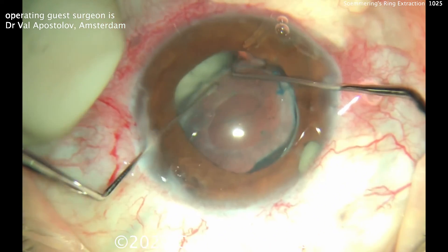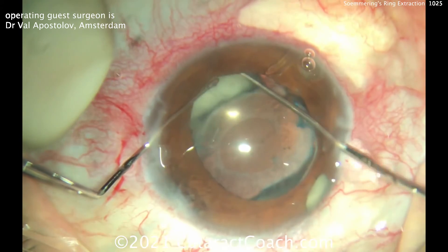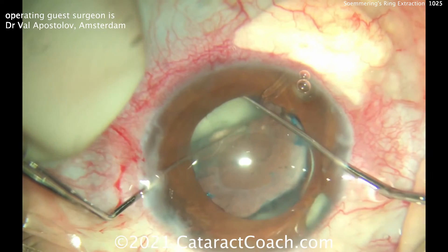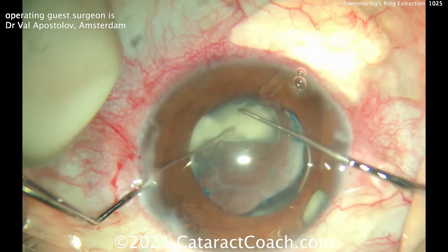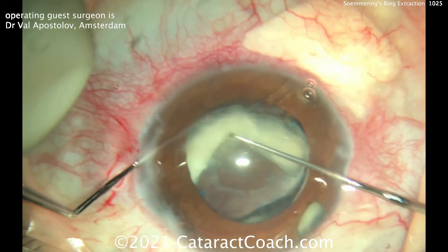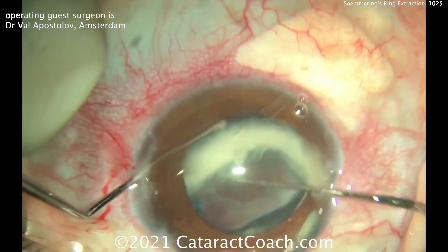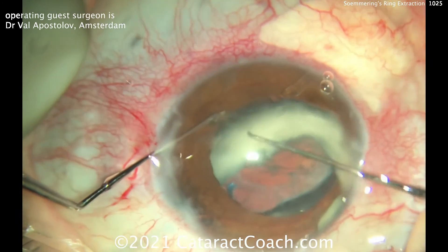He's freeing up this big Soemmering's Ring — it's a huge amount of material. Getting this out of the eye is like doing another cataract surgery. Look how big that is, and that's only half of it. He'll carefully dial this up out of the bag and bring it into the anterior chamber.